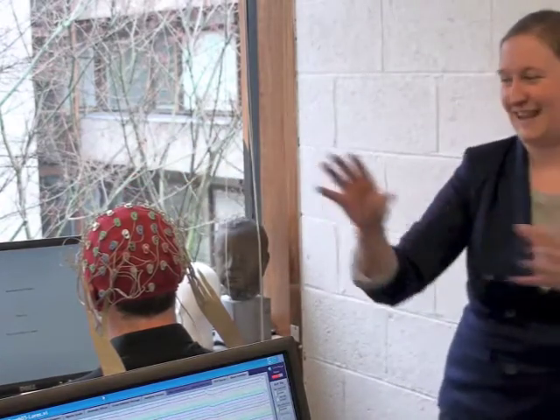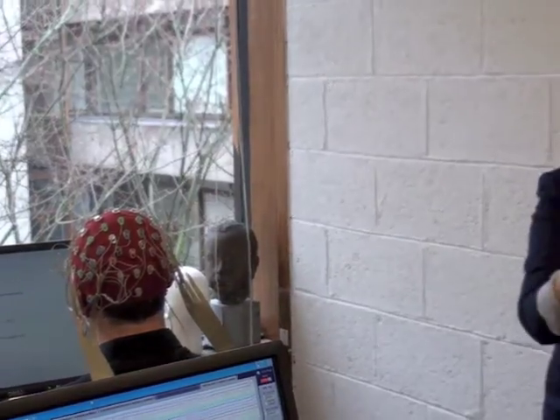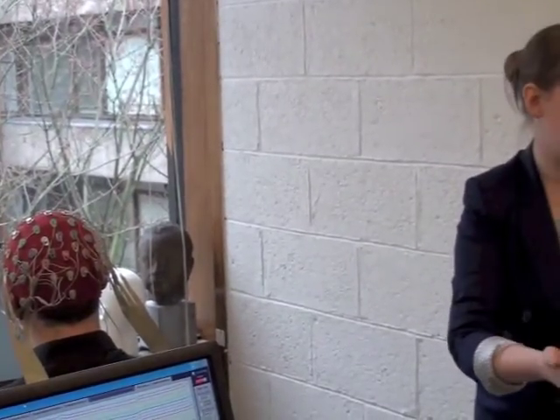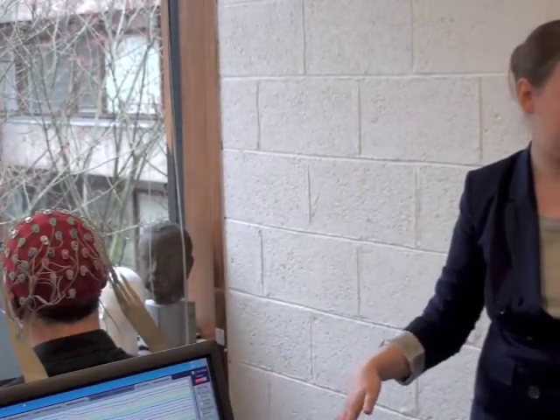When you take Bren's data onto the analysis stage, that's when you mess with where you re-reference the data and you apply the filters. So this is pretty basic, this is easy to do. It's the analysis that's very hard.